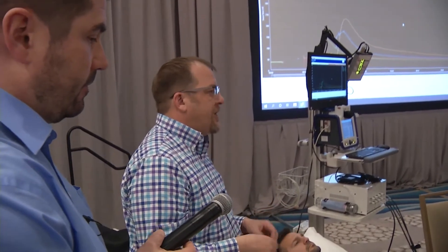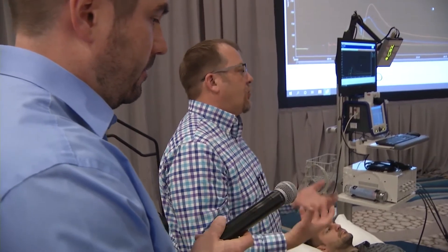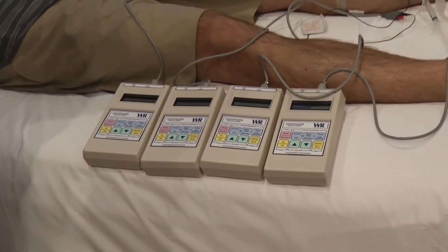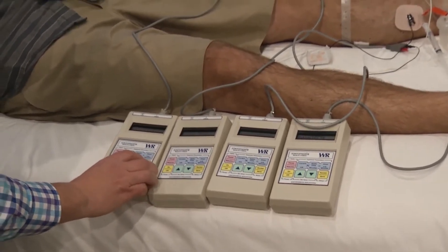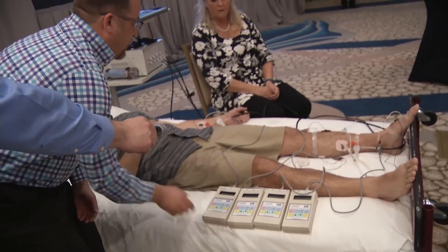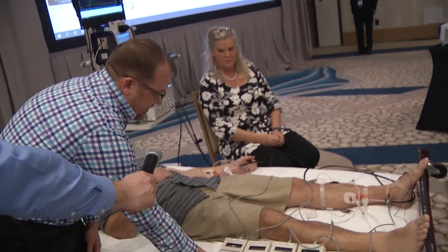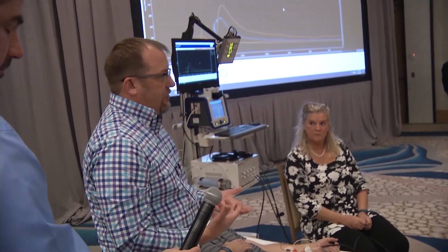I'm going to turn the stimulators on — you're going to hear some beeps as we go through the settings. We're going to set these to run for five minutes at two milliamps. Some of the settings include single phase, which is what we want — we don't use the dual phase option. Polarity is going to be plus, the dose will be set to 10, and then it will get ready for you to ramp up the current to two milliamps.